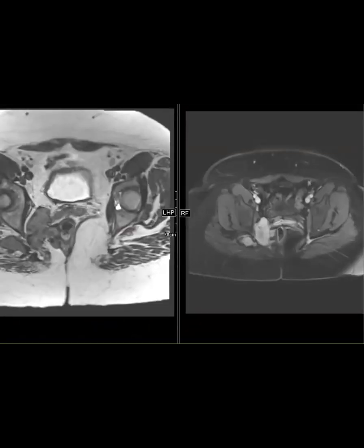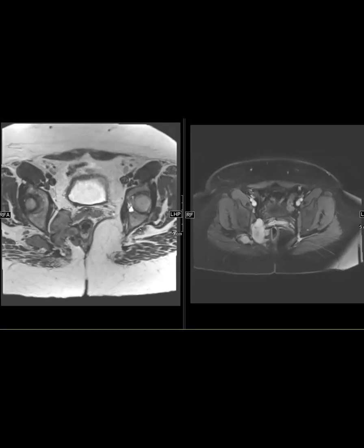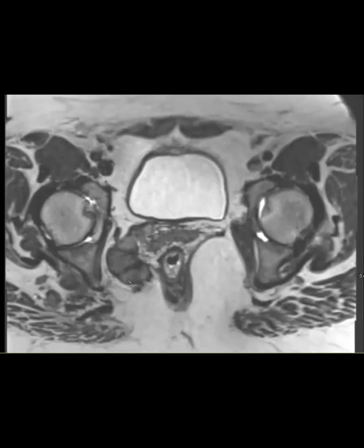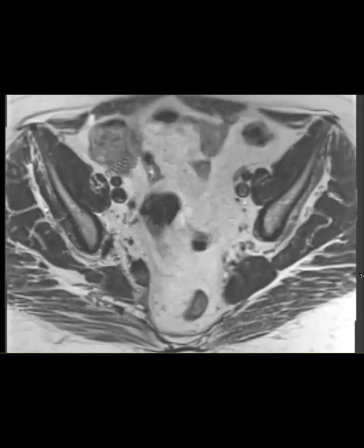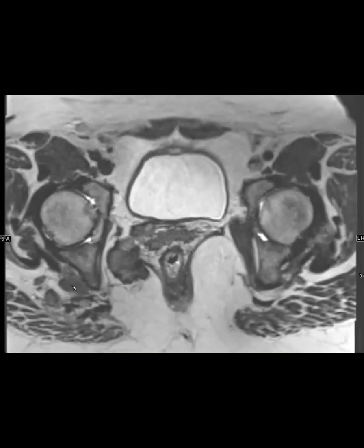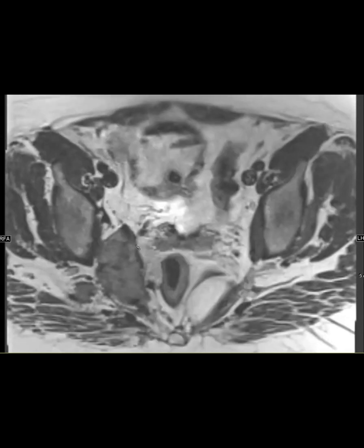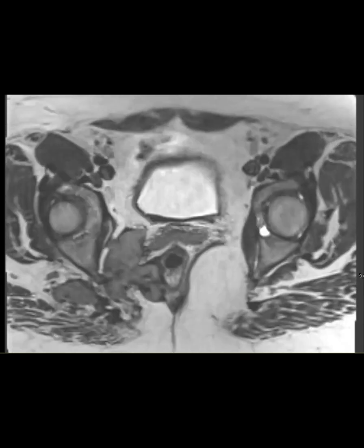This is a companion case to one that Manjul showed last week. So he showed a sciatic notch mass, and I also have a sciatic notch mass here. You can see it looks a little different than his. It looks like it's going through the sciatic notch, but maybe there's a multifocal component to it. It's a little bit more infiltrative rather than looking like that dumbbell-shaped one that he had. Manjul's case was a schwannoma, mine is not.